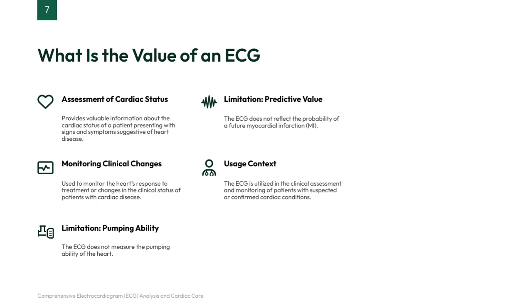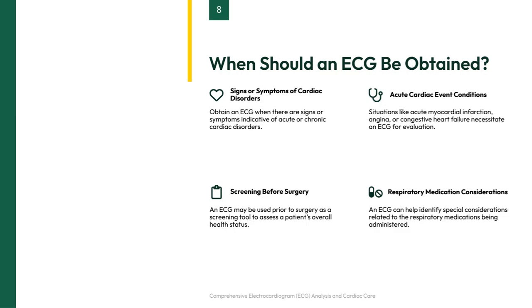Despite these limitations, the ECG remains a critical part of clinical assessment and ongoing monitoring for patients who might have or are known to have heart problems. An ECG should be obtained whenever there are signs or symptoms suggesting a cardiac disorder, whether acute or chronic. This helps us identify any underlying heart issues that need attention.